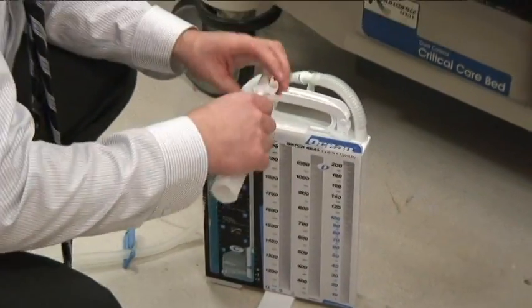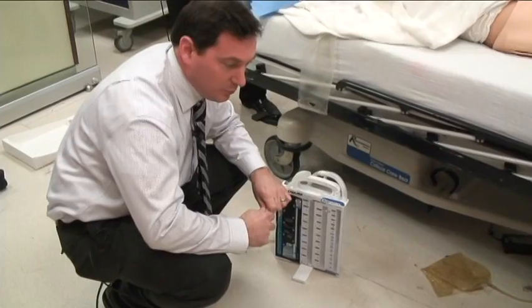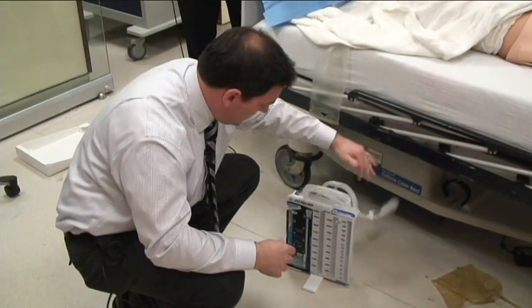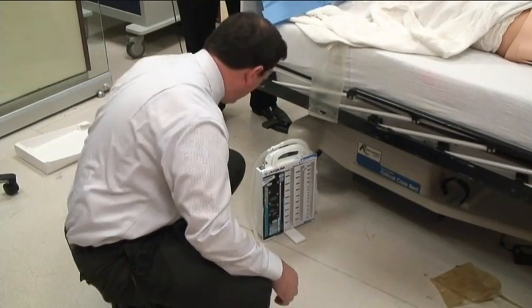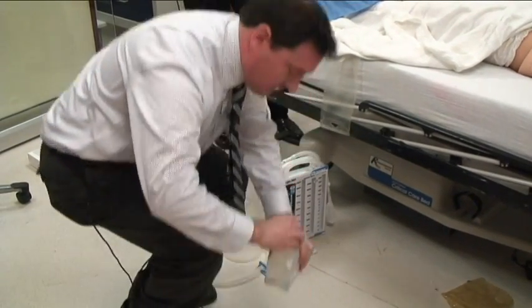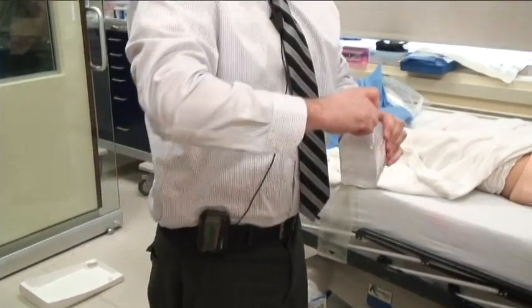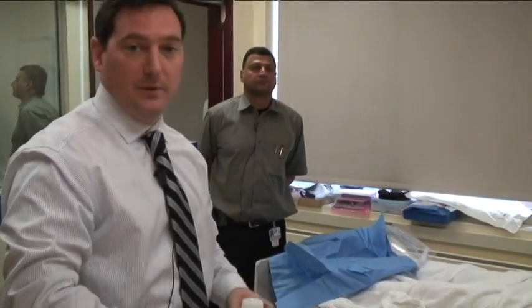We're ultimately going to connect this. If you want to go to suction, you'll connect this then to the suction. This piece is easily removed, and you can connect it to the suction. But for our purposes, I'm going to leave that alone for the moment, and we'll connect this to the patient when we're ready. Okay. I'm going to go ahead and get in my sterile gown, and then Dr. Gopal here will assist me in opening up things so that we can proceed with the placement of the pigtail catheter.